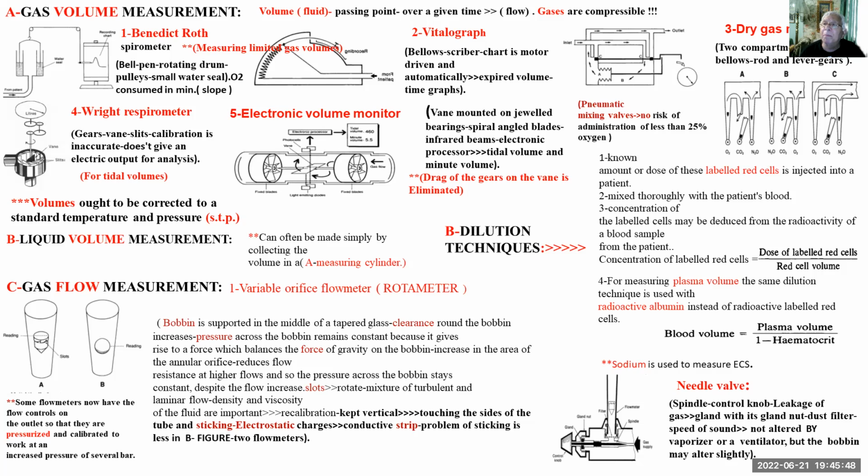This drawing on the upper right part of the screen, in the book it comes later on, but I wanted to utilize the space. We can see the arrangement of the flow meters in the United States. We have the carbon dioxide, whether it's in the middle or on the last one. We have oxygen in a special pathway, so that in case we have a breakdown in the middle of the flow meters, the oxygen will not be affected, as we can see from this diagram. This system makes the construction of the anesthetic apparatus use what we call a pneumatic mixing valve whenever we are using nitrous oxide and oxygen, to assure that we have a proper oxygen concentration, so that we will not have an anoxic mixture made of nitrous oxide.